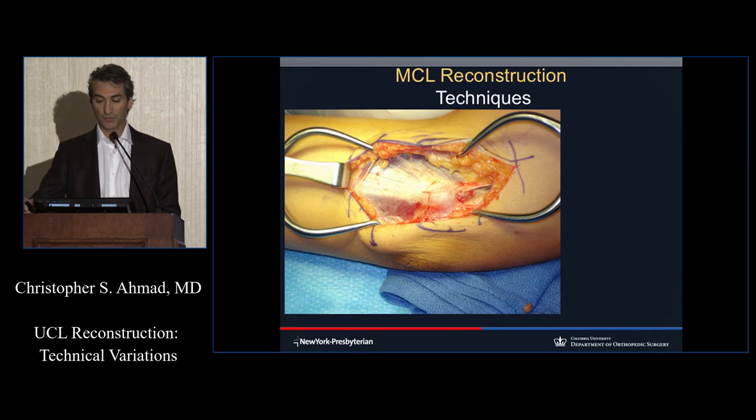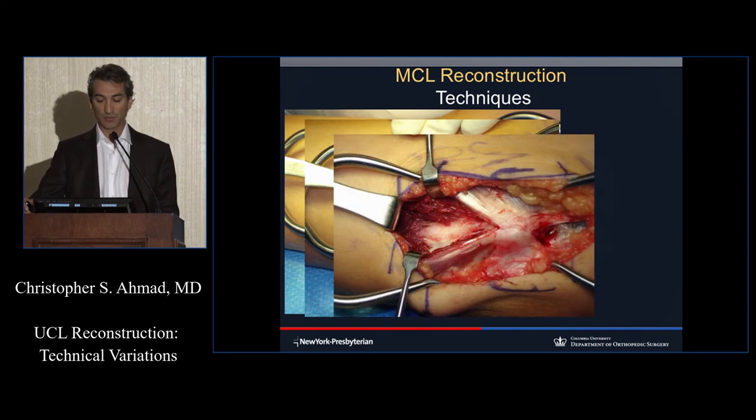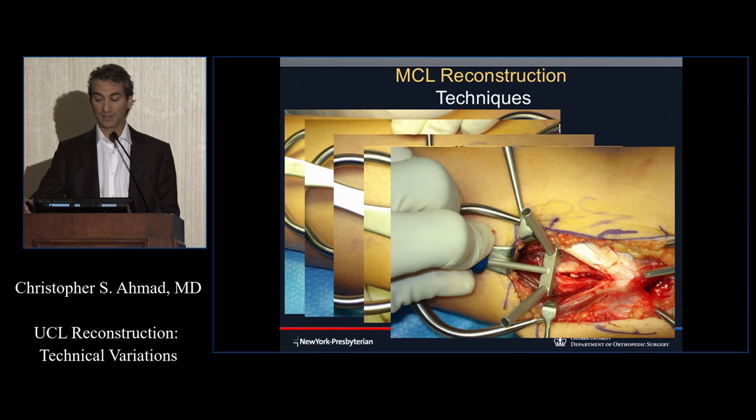Here, many people in the room on the faculty are involved in creating instrumentation so that when we expose the ligament, flexor split here, and then we get exposure, we can put in guides and get a good bone bridge and make sure that it's going to work out properly. I'll tell you this. I had somebody call me up and he said, I fractured the bone bridge and I used the guide. I don't know what to say.